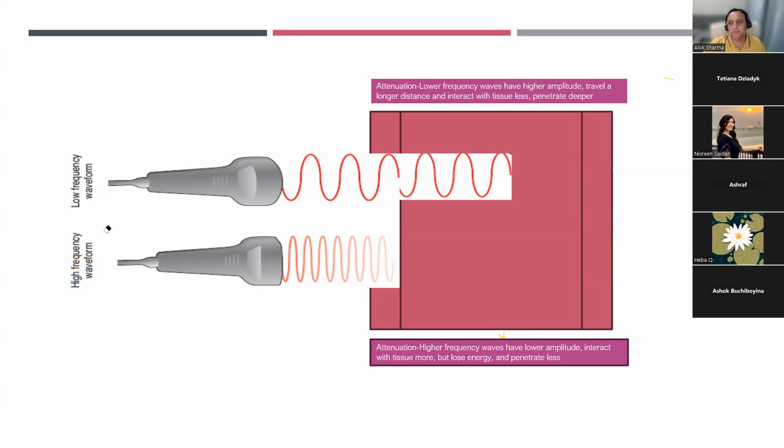High frequency for extreme preterm, because the organs are more superficial than in a bigger baby. So a bigger baby will use low frequency with the long wave. It will penetrate more like this. Brilliant, brilliant. So what Nasreen is saying is quite relevant.